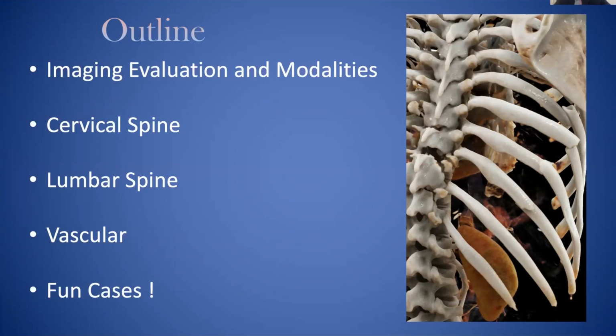Then a rundown on the various imaging modalities available to us, and when you might want to consider ordering or referring for a particular test, or using a test to guide your clinical assessment, preoperative planning, or follow-up on a patient. And again, that's very broad. I've highlighted things that I think would be particularly pertinent to a neurosurgical spine surgeon, as opposed to all the imaging modalities available in the radiology department.